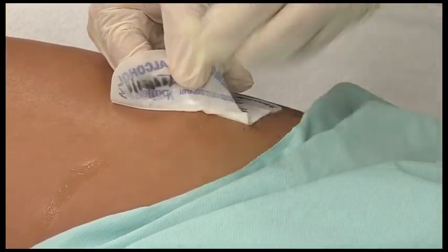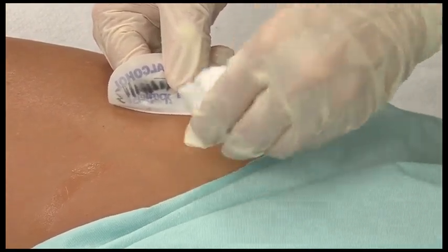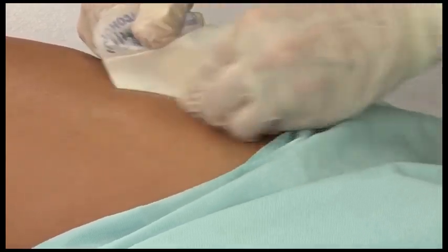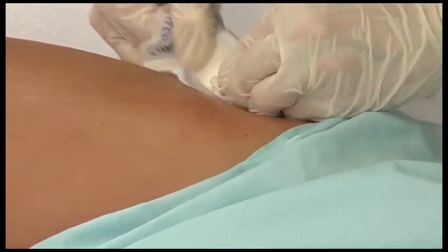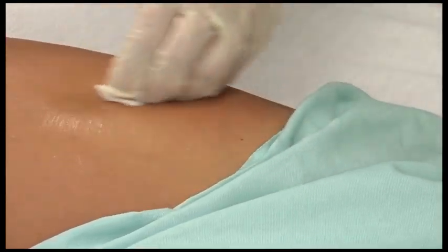Stack and fold 5 to 6 alcohol pads and wipe the edge of the pad until a corner lifts. Then continue to wipe the undersurface of the pad in a back and forth motion by squeezing the alcohol out to dissolve the adhesive pad away from the skin.